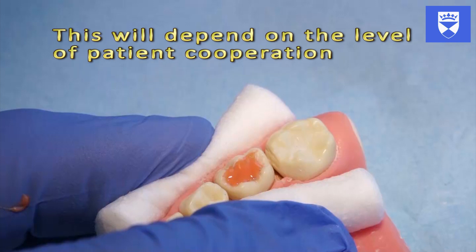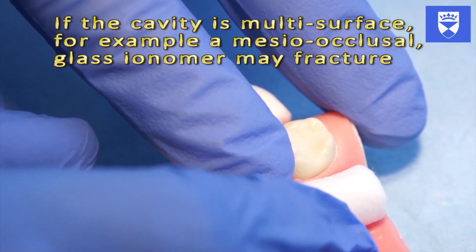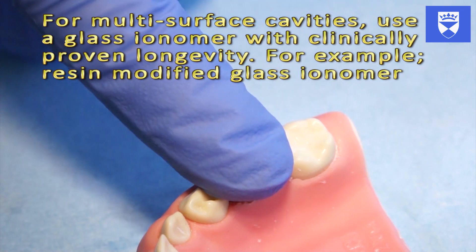Place your finger over the tooth ensuring that the occlusal surface is completely covered. Keep the fingertip firmly placed over the occlusal surface and restoration for a full two minutes until the glass ionomer has set.